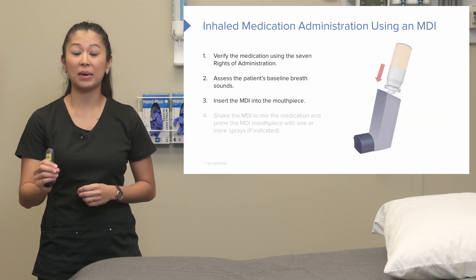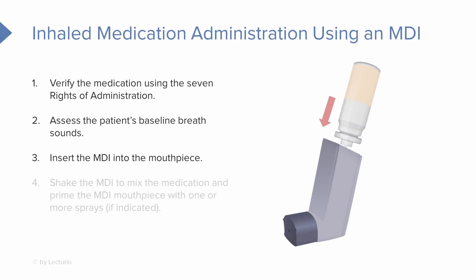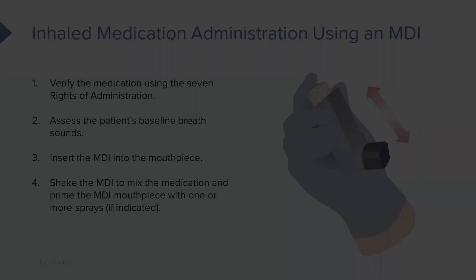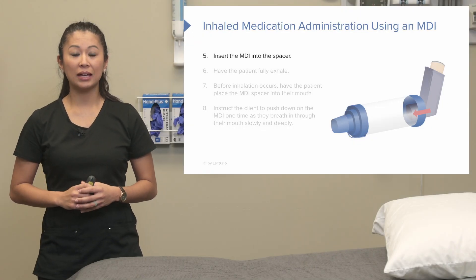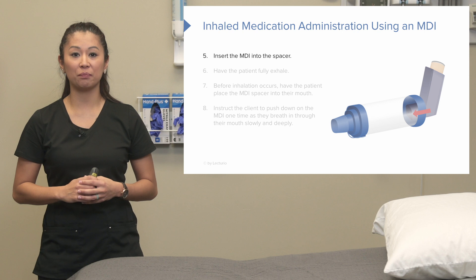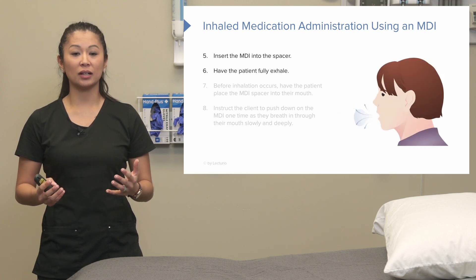Now let's talk about medication delivery. Take the drug and put it into the mouthpiece, then shake it up to thoroughly mix the medication. Next, prime the inhaler by pushing the medicine into the mouthpiece and giving it a couple of sprays. We do this before giving it to the patient to get the medication all the way to the end of the mouthpiece. If a spacer is indicated, connect it at this time.